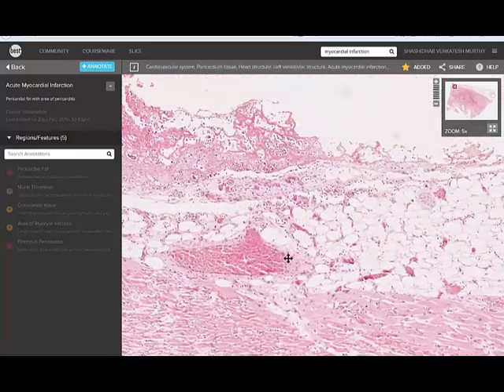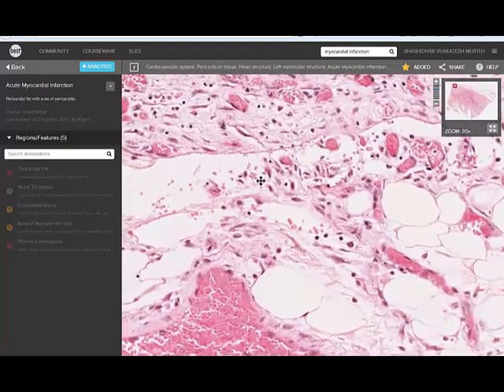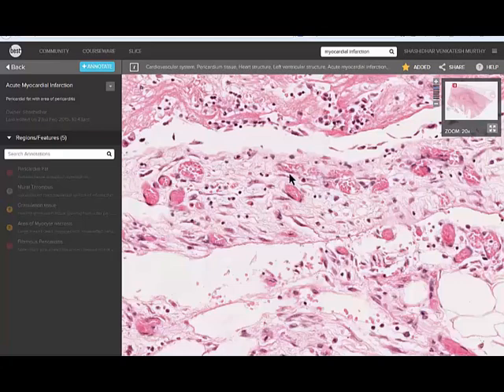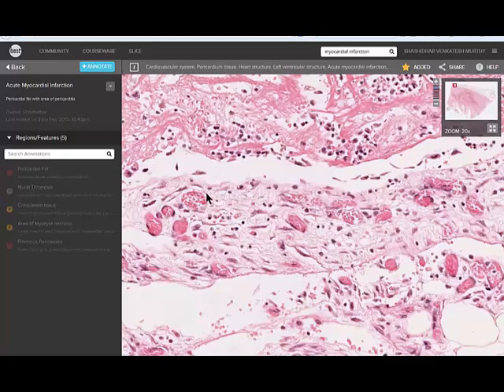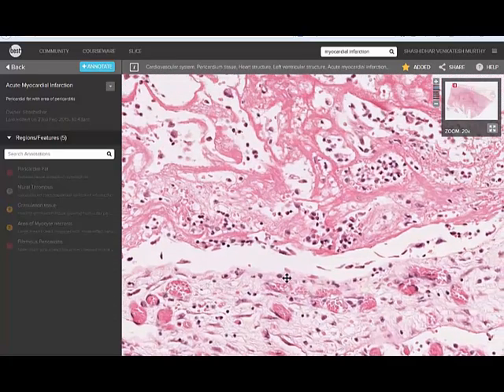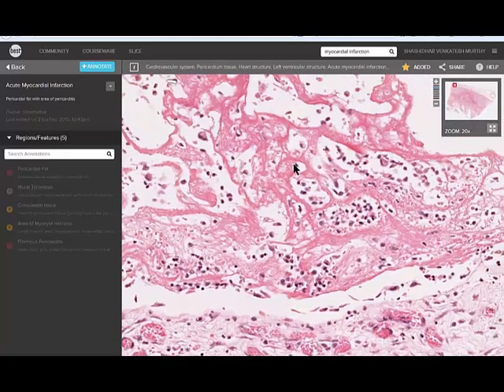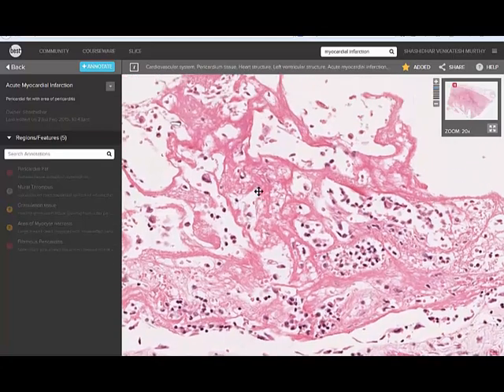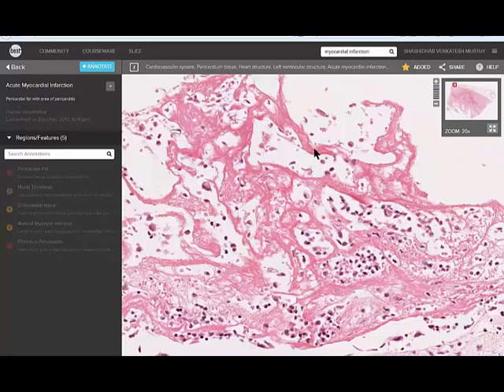Observe the blood vessels are all dilated, congested with plenty of RBCs inside these capillaries, dilated capillaries. Remember the inflammation. Fluid leaks out from the capillaries during inflammation and the endothelial damage results in protein leakage and that protein, when it leaks out in the pericardium, it gets coagulated as blood clot. When there is only more of protein and less of cells, it will be known as fibrin clot because it is more of fibrinogen which is coagulating. It is a blood clot with few of WBCs and RBCs.